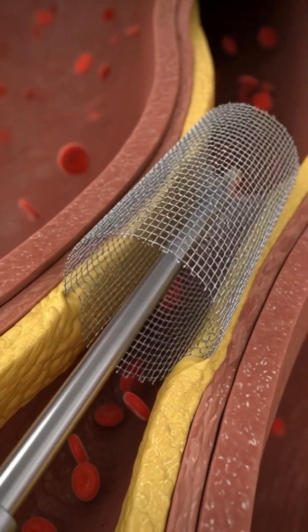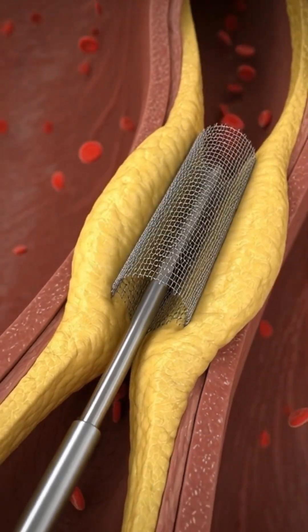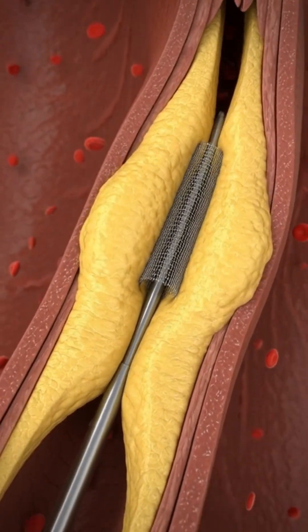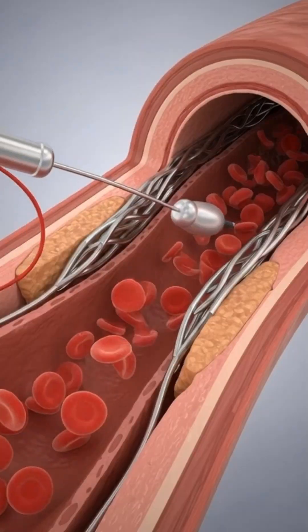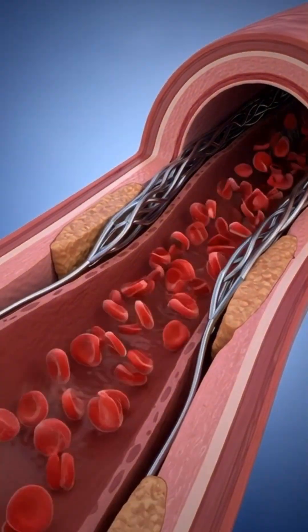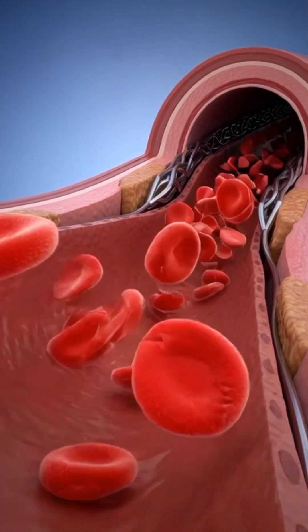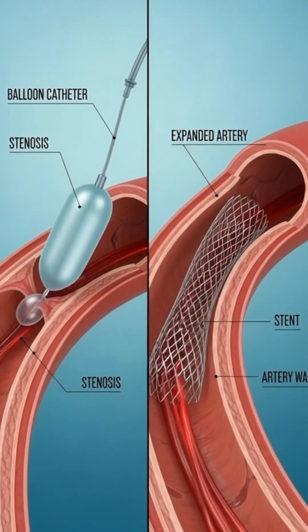When the balloon inflates, the stent expands and presses the plaque outward. The balloon is removed, but the stent stays permanently to keep the artery open.